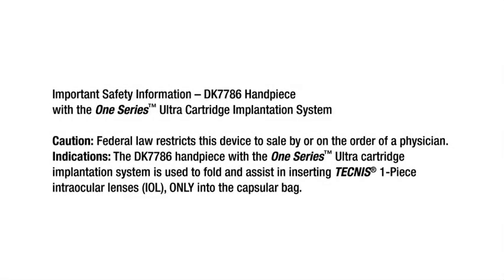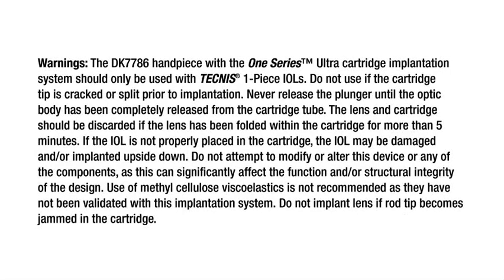Federal law restricts this device to sale by or on the order of a physician. The DK7786 handpiece with the 1 Series Ultra cartridge implantation system is used to fold and assist in inserting Tecnis one-piece intraocular lenses (IOL only) into the capsular bag. The DK7786 handpiece with the 1 Series Ultra cartridge implantation system should only be used with Tecnis one-piece IOLs.